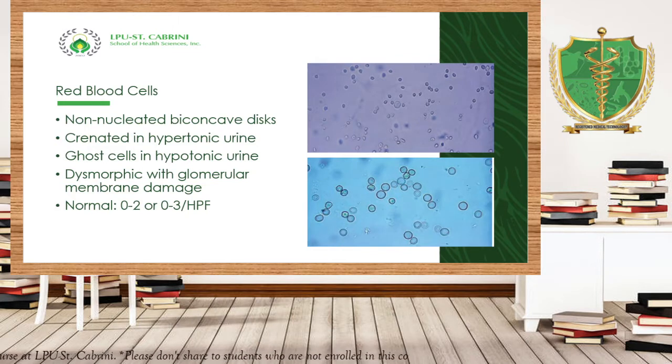Ngayon, sir, you might ask me, sir, is it the same structure or appearance that we can see under the microscope for urine? Well, of course, yes. No? Ano yun, nabago yung itsura ng RBC under the urine because mapanghi, because of the ammonia-like odor of the urine? No, it is not like that. However, well, possible. Possible if the urine is hypertonic.